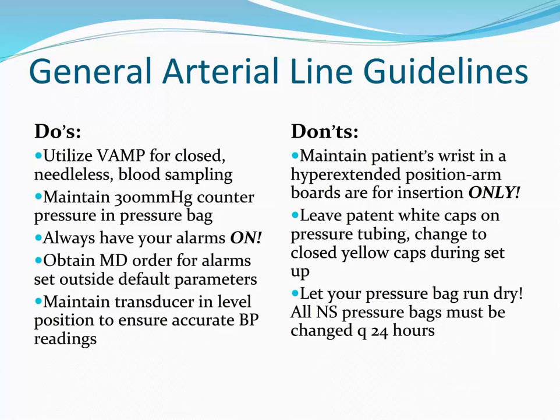I'm going to take an extra minute here to help everyone understand the importance of this point. A-lines are configured in our telemetry system with a 3-star alarm. A 3-star alarm represents an emergency. So when you turn this off, you place your patients at serious risk. The 3-star alarm goes off when the pressure against this invasive line is no longer detected. This happens when it gets disconnected or you turn your stopcock to the off position.